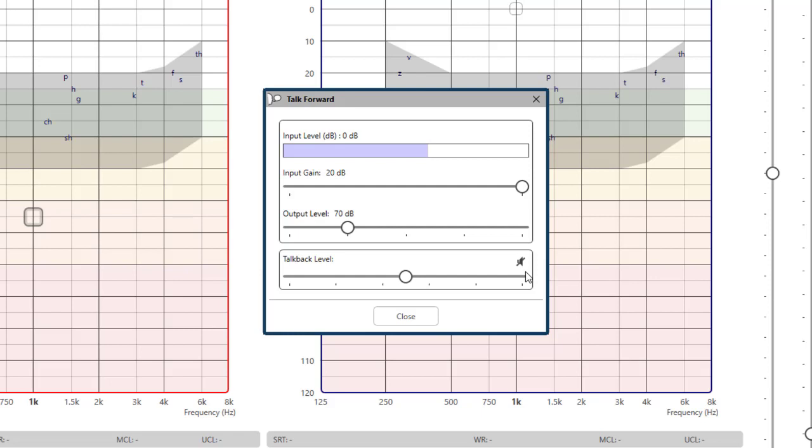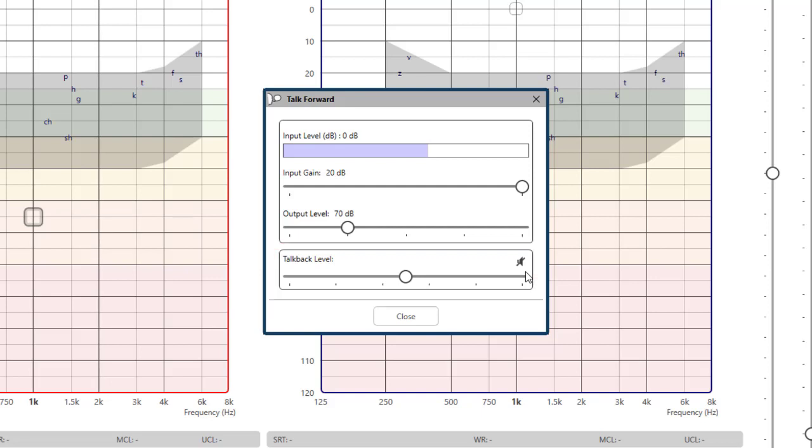The talk back level controls the volume in your monitor headset when listening to the patient from the talk back mic. Some headsets have a manual volume control on the cable and some do not. You can adjust with the manual VC if you have one or in the talk forward option. You can enable or disable your talk back mic here as well.